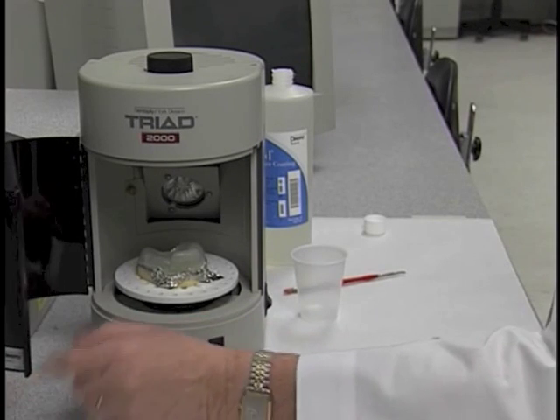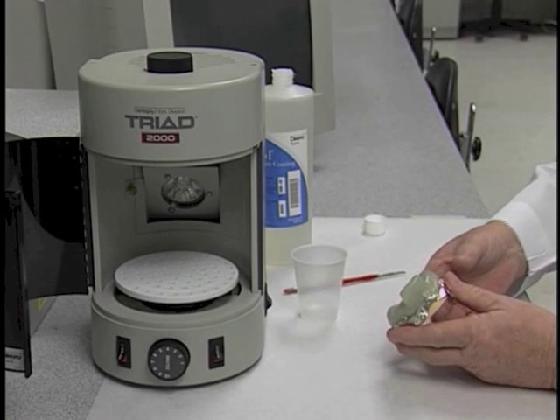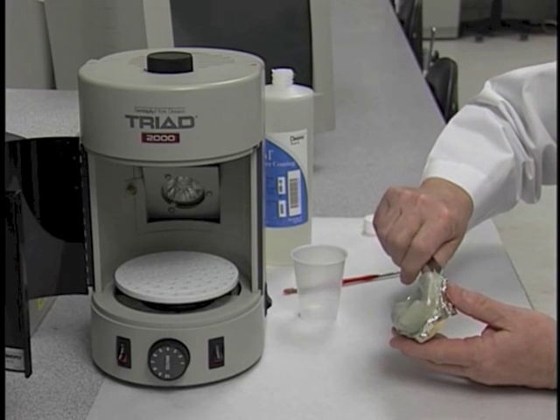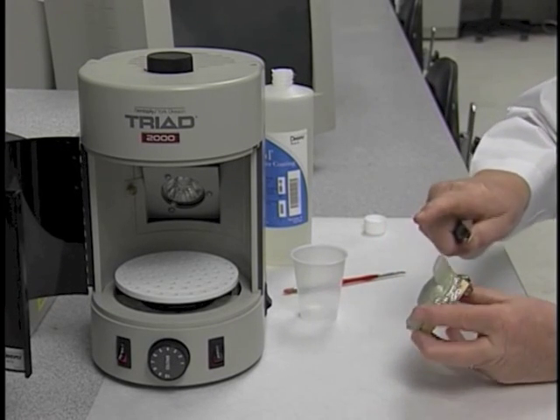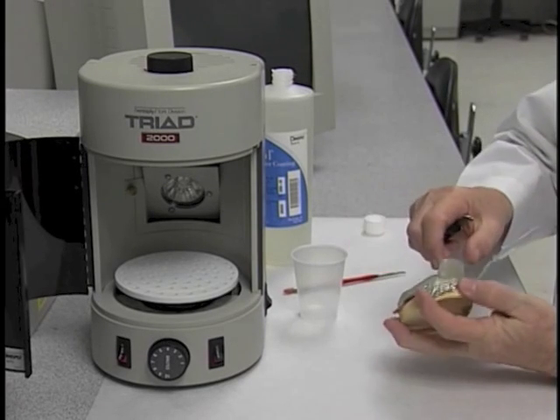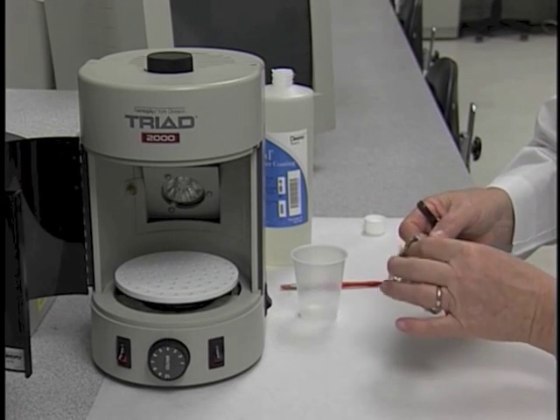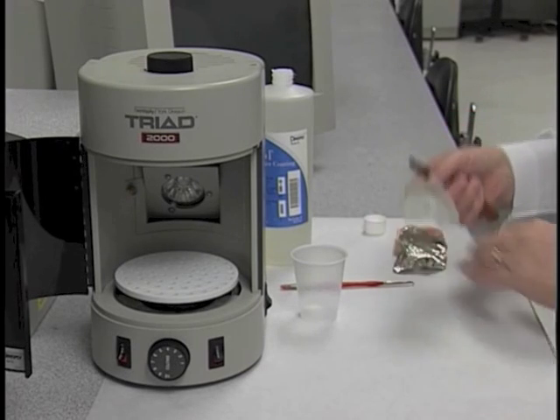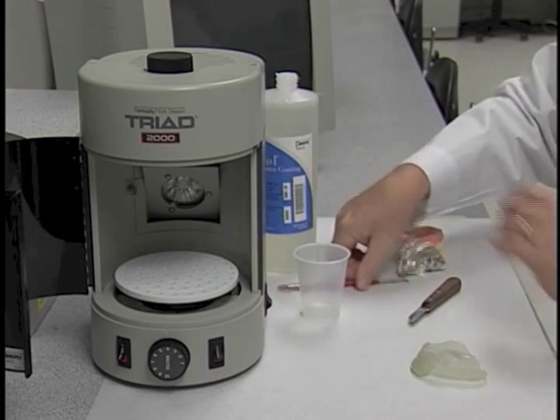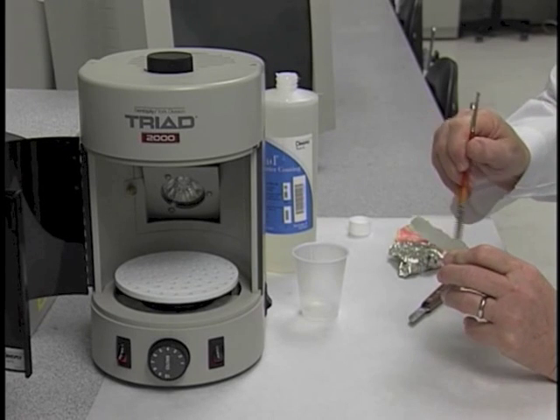Now that the 4 minutes is up, we can remove this from the unit itself. And the next thing we wish to do is to pry the tray from the cast. Now we can take the tin foil from the inside of it. And now we're going to paint the inside of the tray with the air barrier material.